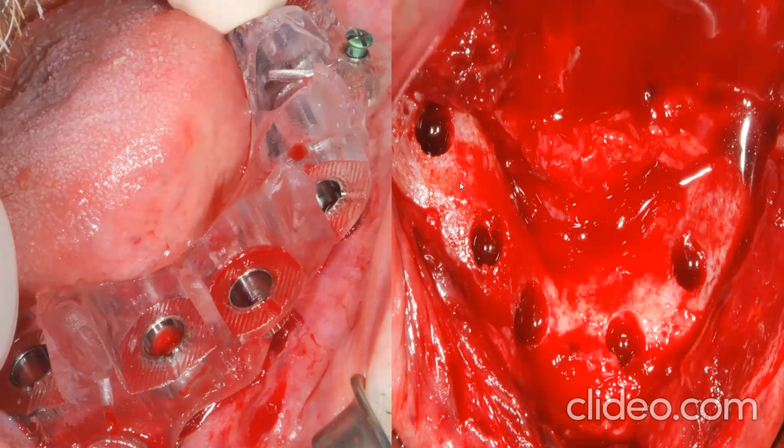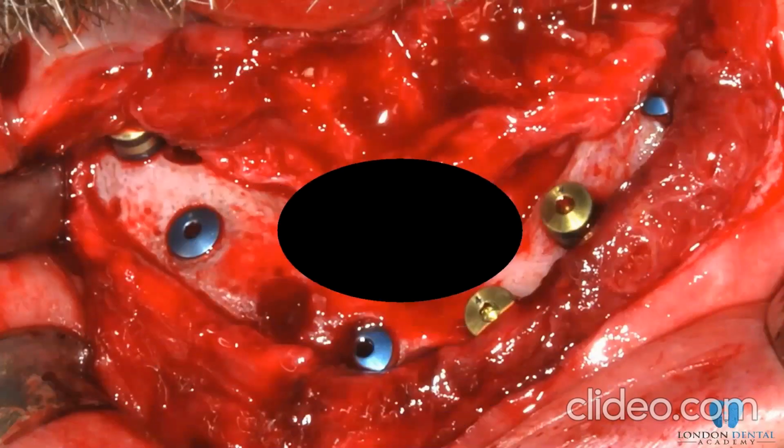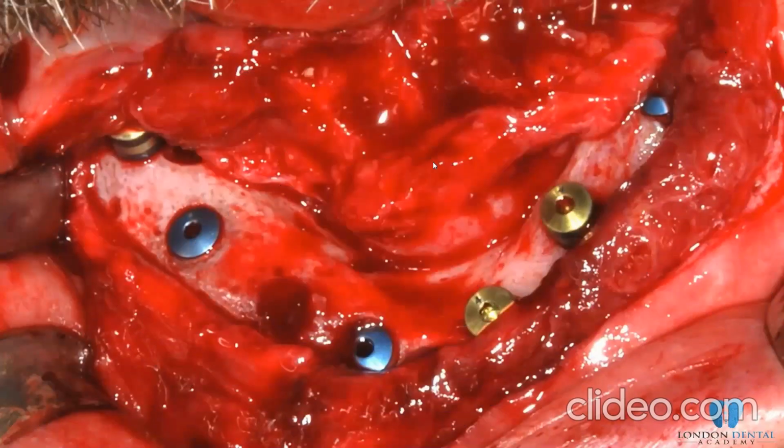When I opened the area, I did these osteotomies freehand. I put the stent back again to see the difference between guided and non-guided, and look what I found. The first implant site was almost on the lingual surface. Look at the other side, almost on the buccal surface. The third, almost on the lingual side again. Basically, like 50% of the implants were not in the position where I wanted them to be.